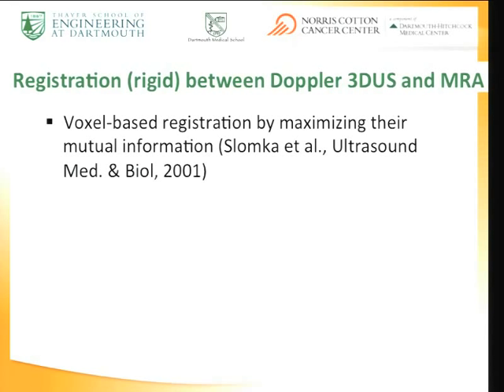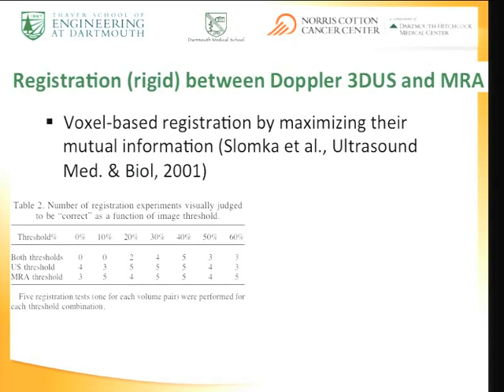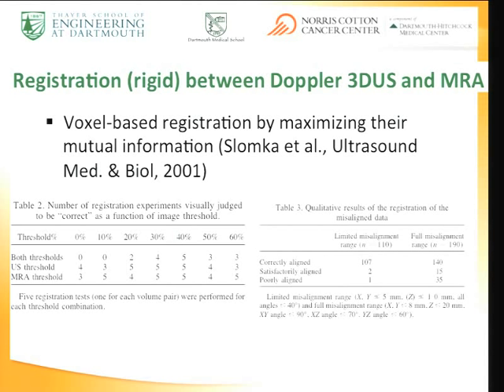You can't talk too much about this sort of stuff without referring to the Fenster group. So they were interested in carotid artery registration with MR obtained with Doppler ultrasound. Just copying a couple of tables out of that paper here from 2001. What they looked at were some of the issues with image intensity between ultrasound and the MRA. And just show here with a particular setting, this is the five patients that they were looking at. You could find that all five produced quote-unquote correct, at least visually accurate, registrations. One of the tricks in this is the so-called capture range. Once it's registered, what if you perturb the registered information, and can you get back to that registration? How far can I perturb that off?